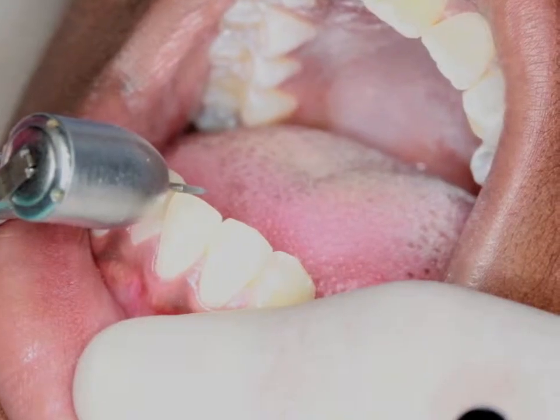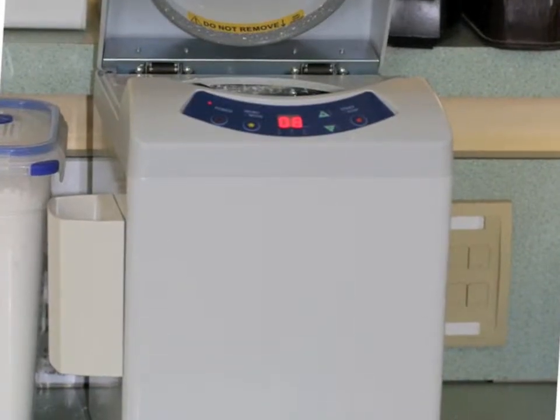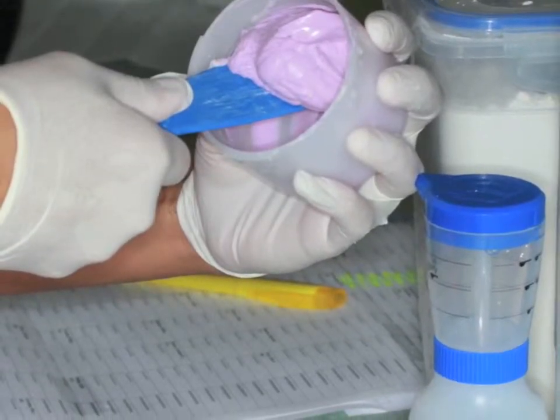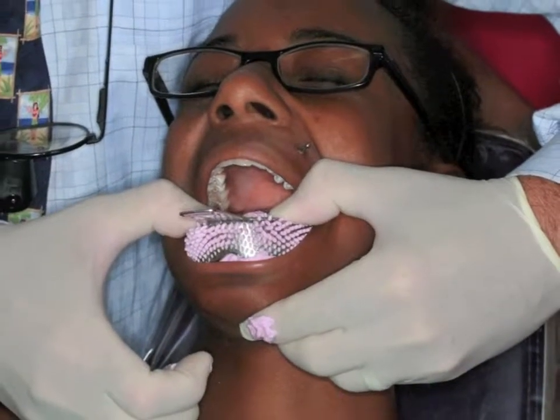Sometimes we adjust incisal edges prior to impressions to allow more accurate bracket placement. The TurboMax Alginate Centrifuge and Raintree Essex Color Change Alginate yields the most accurate alginate impression we have found to date.